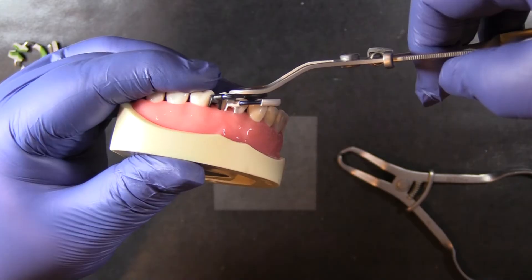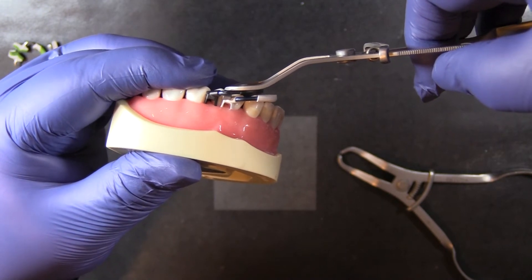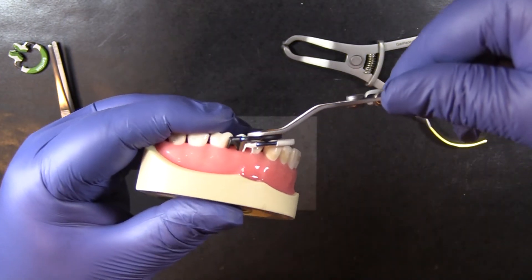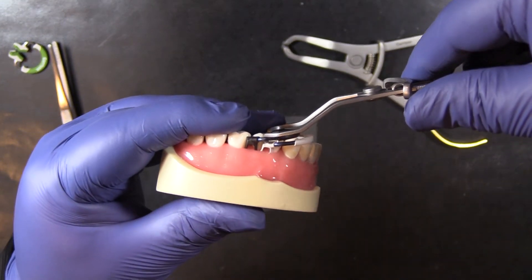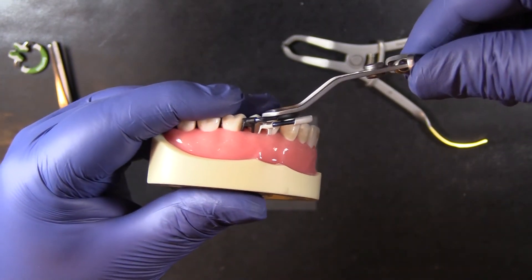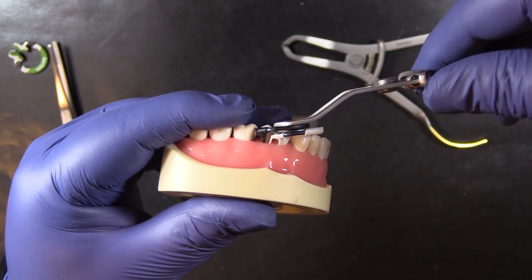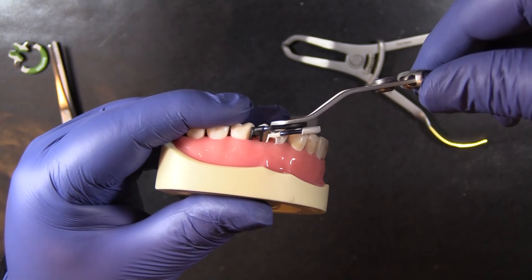You can see here how far down that tip is hanging — it creates some interference. The Nitin forceps are designed to compensate for that, and you can see there's nothing hanging down below that upper ring to interfere or try to grab the lower ring.